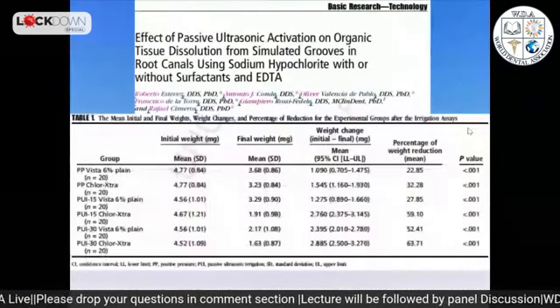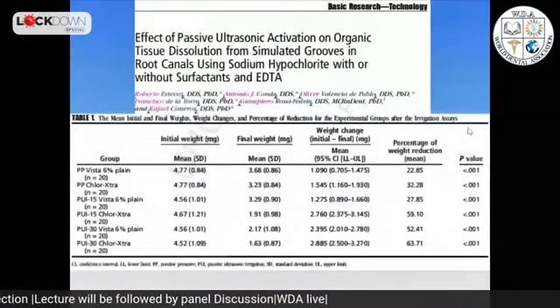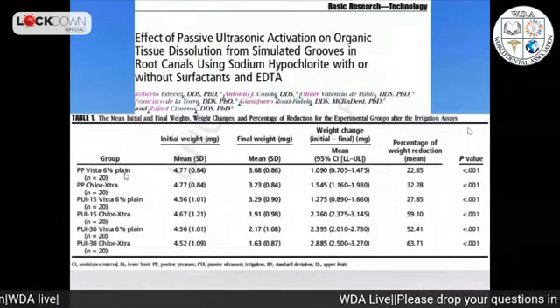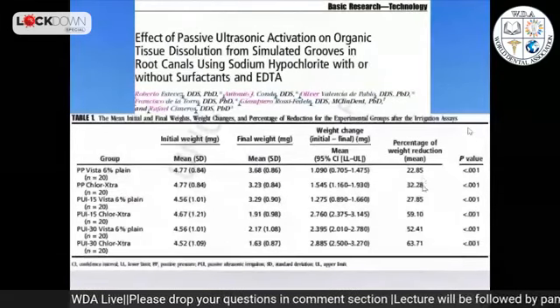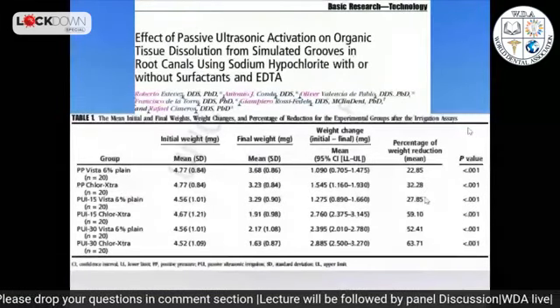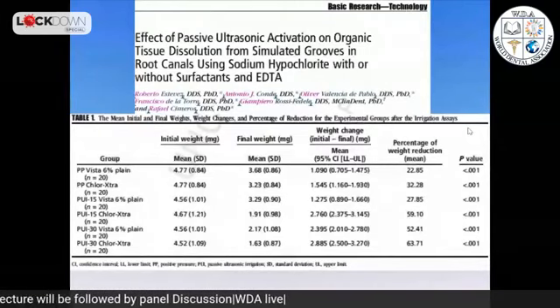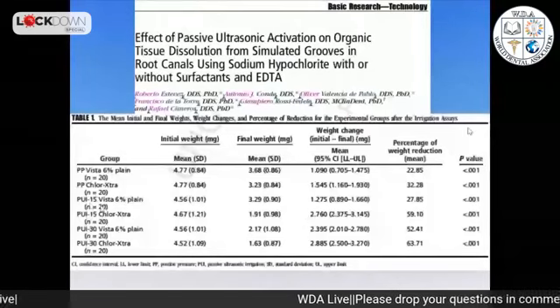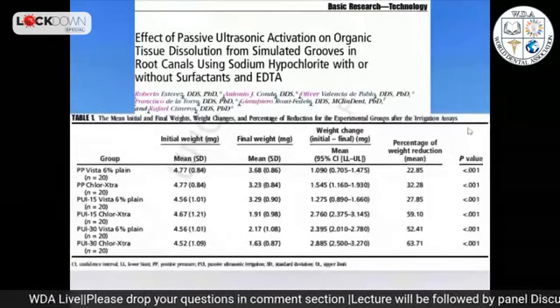Now here we compare sodium hypochlorite with surfactant and without surfactant. So this one, plain, means it has no surfactant. This one has surfactant. And if you see, there is always an effect. So if you have a surfactant, there is a little bit better dissolution. And this can be enhanced by activation. If you do 15 seconds of activation, it improves.